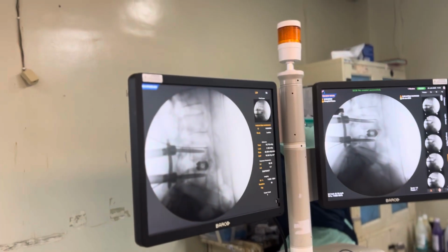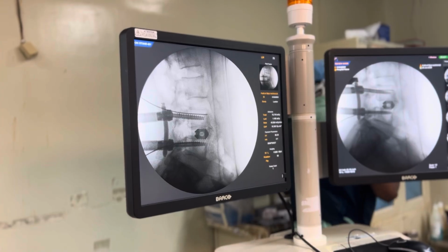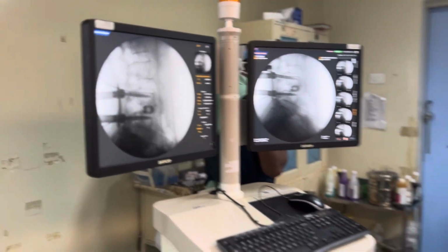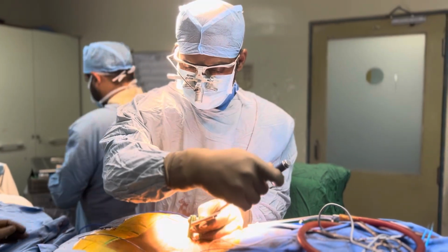We have confirmed that the rod length is adequate. Both the nuts are properly tightened with the torque limiting screwdriver. Now there is an instrument to break these sleeves.